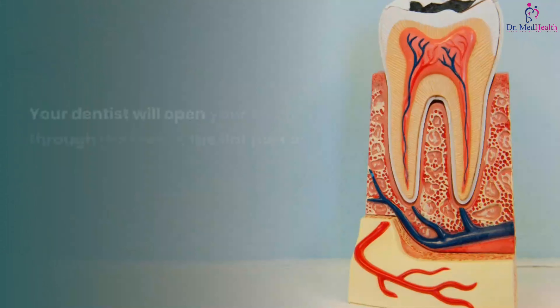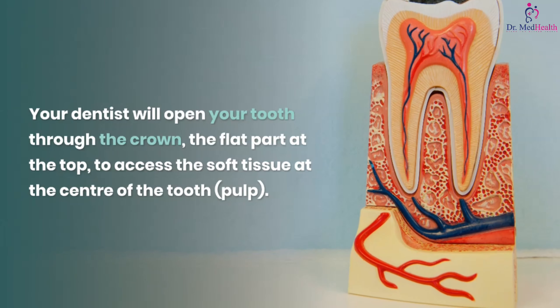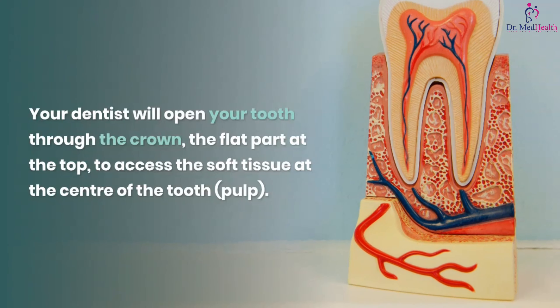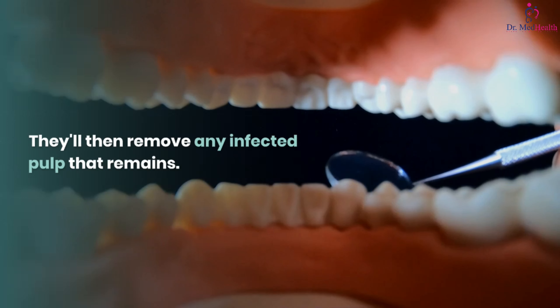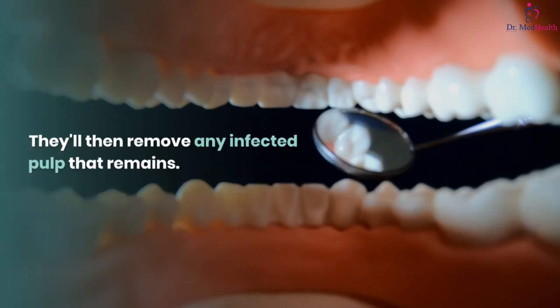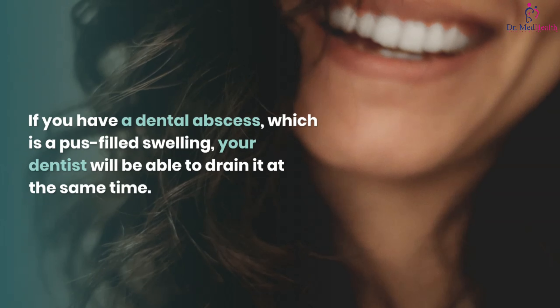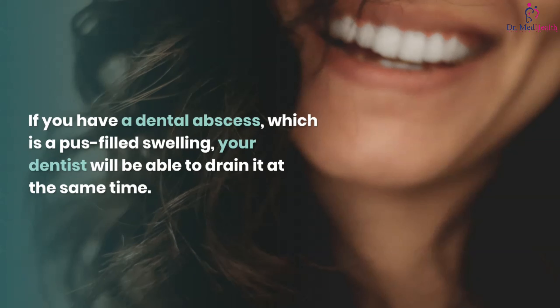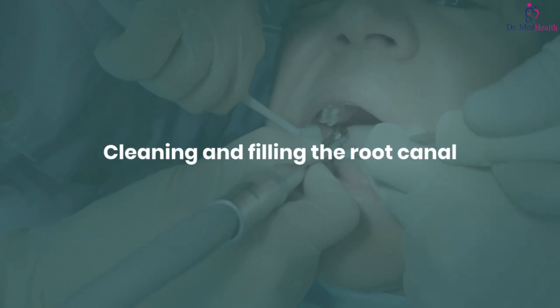The dam also prevents you swallowing or breathing in any chemicals the dentist uses. Your dentist will open your tooth through the crown, the flat part at the top, to access the soft tissue at the center of the tooth, the pulp. They'll then remove any infected pulp that remains. If you have a dental abscess, which is a pus-filled swelling, your dentist will be able to drain it at the same time.